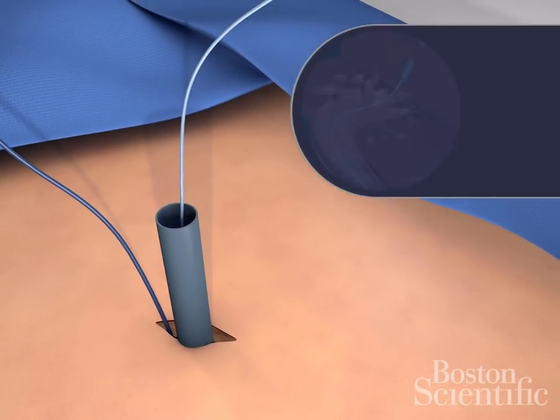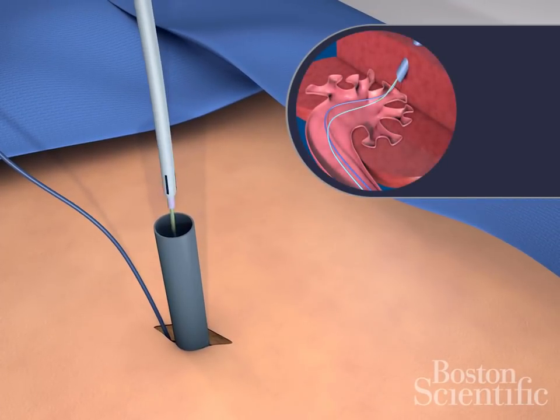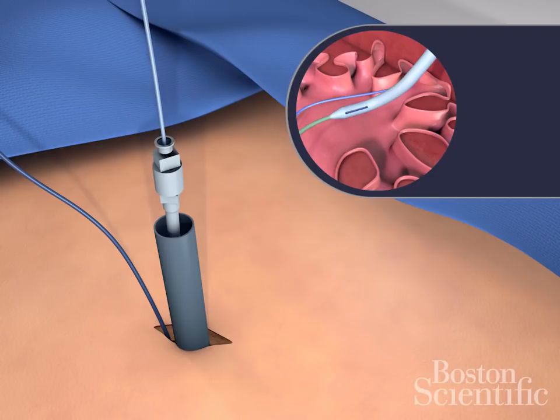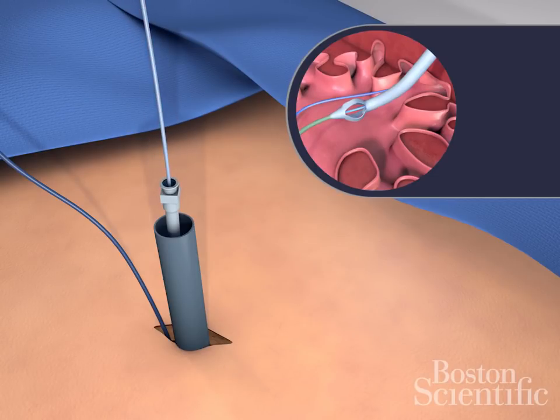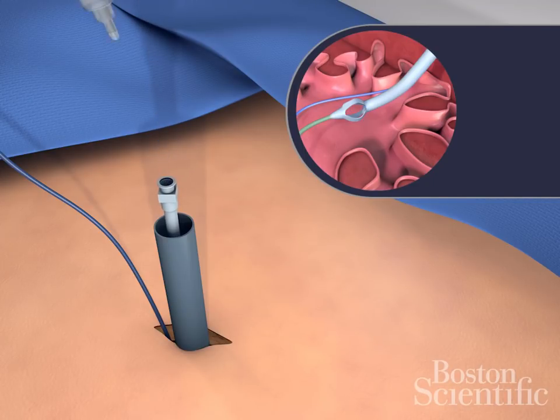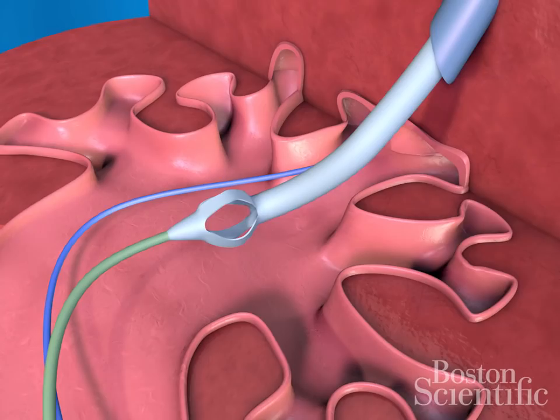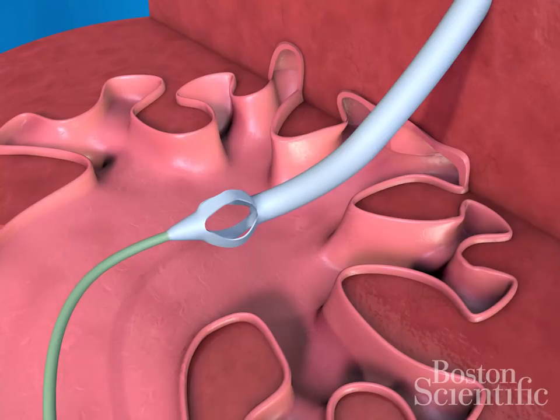Insert the nephrostomy drainage catheter into the sheath over the working channel. Remove the inner stylet from the catheter to enable the catheter to open inside the kidney. Remove the stiff working wire from the catheter. Using the syringe, inject contrast through the catheter to confirm its proper placement on X-ray. Remove the renal sheath and the remaining guide wire to complete the procedure.